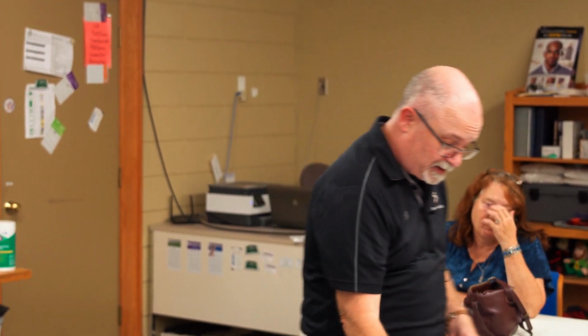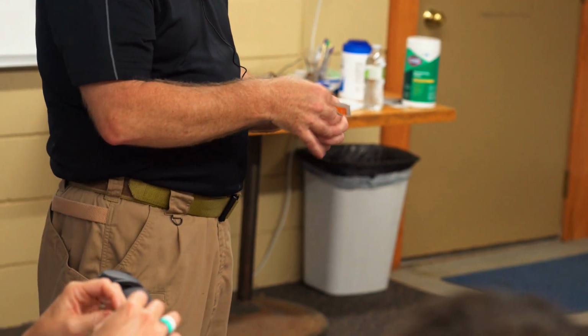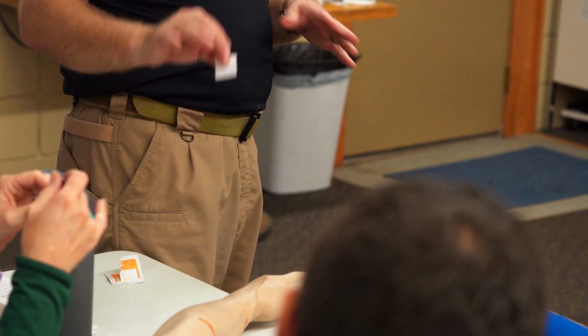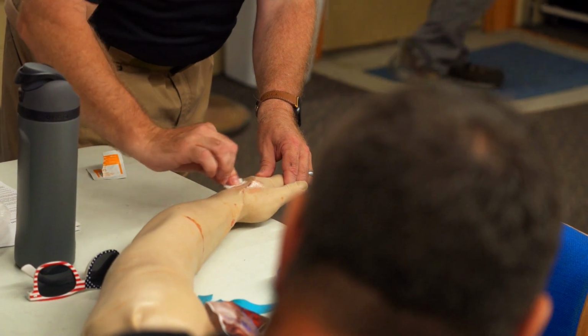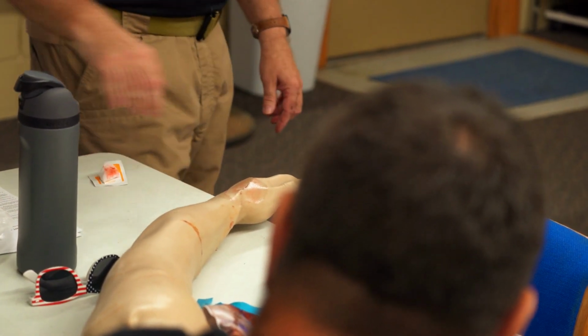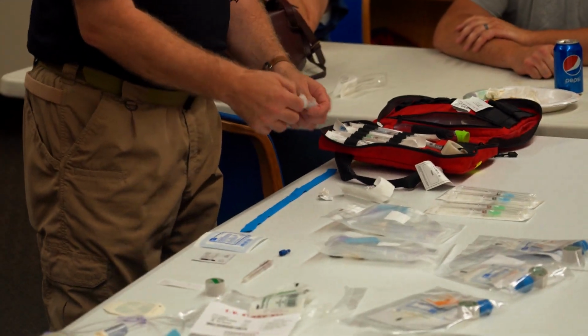Infection. So being able to do the skin prep, I'll just use an example, we're going to have to use the iodine. I'm not going to do that on my mannequin arm here, but using this, wherever you need to get cleaned off that you're going to do your site. I'm doing this backwards, but I just wanted to cover it. Start where you're thinking you're going to try, and then you slowly make circles on your way out. If you need to do it a second time or a third time, grab more. I'm guessing you've got more preps floating around. Yep, so that's also going to be handy. So here's another one.